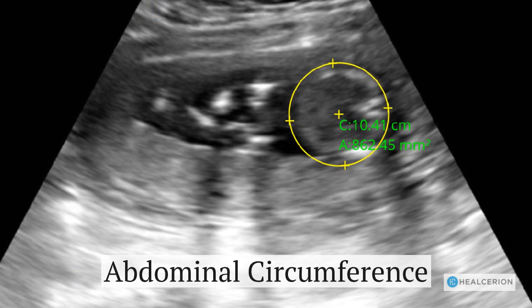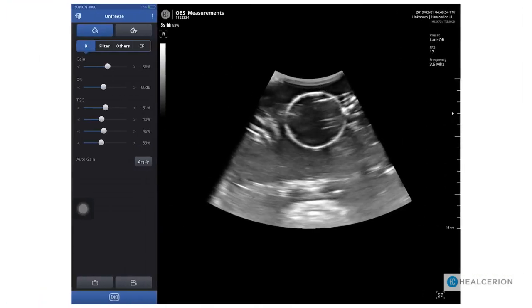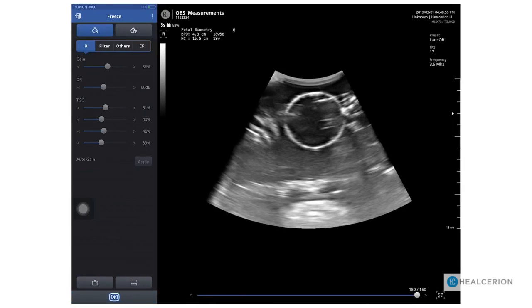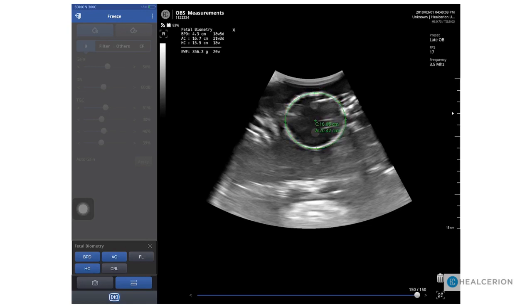Again using a phantom, we'll look at how to do the abdominal circumference. Scan to achieve the correct image for the abdominal circumference measurement. Open the menu and choose abdominal circumference. Tap the first caliper then the second and again use the light gray dots below the calipers to position it accordingly for the correct measurement. Notice in the upper left hand corner all of the parameters are being populated as the measurements are done.